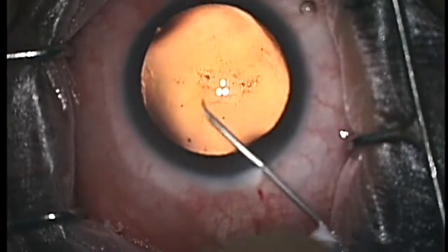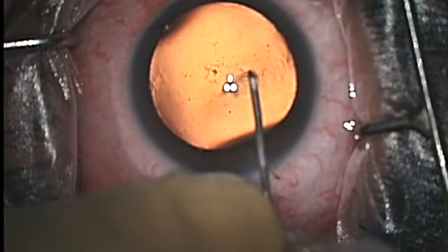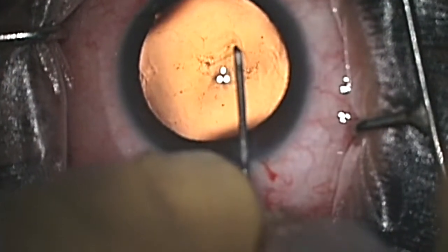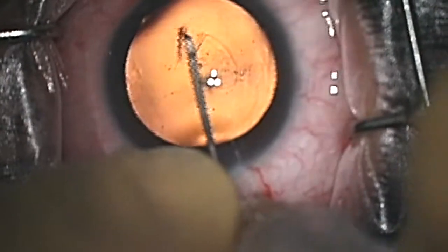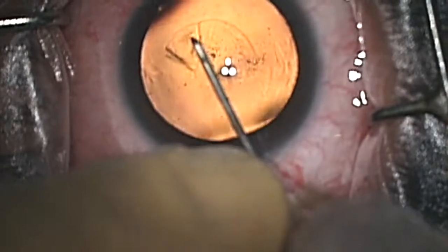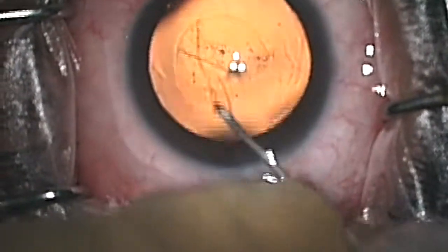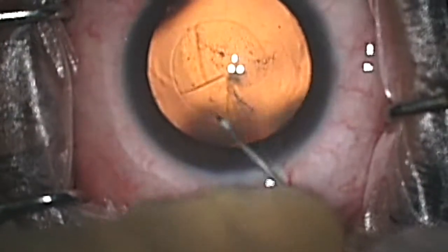We start off by making one incision in the eye, which is a 2.2 mm incision, after which we inject a viscoelastic inside the eye to really form the anterior chamber, after which we're using a 26-gauge needle to make an opening in the capsular bag.